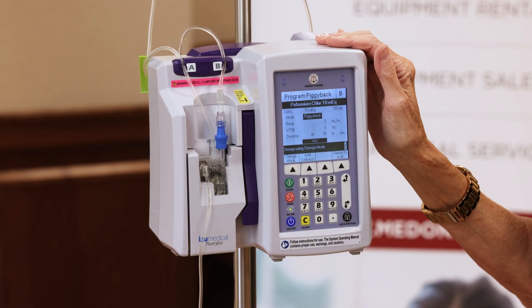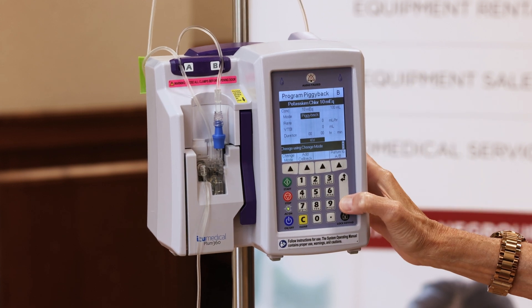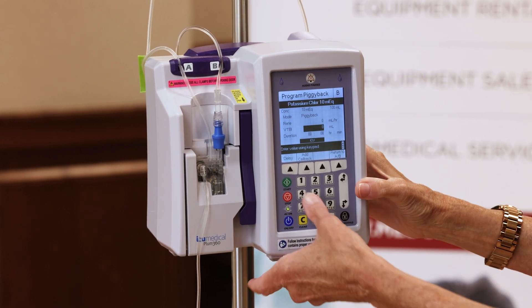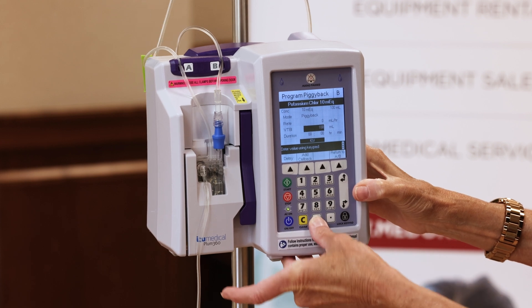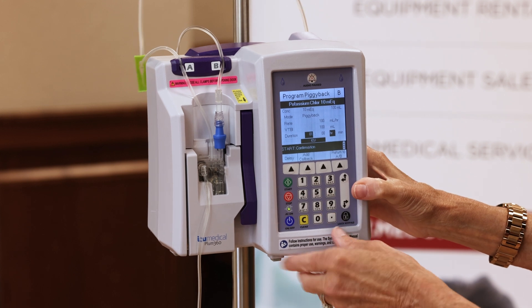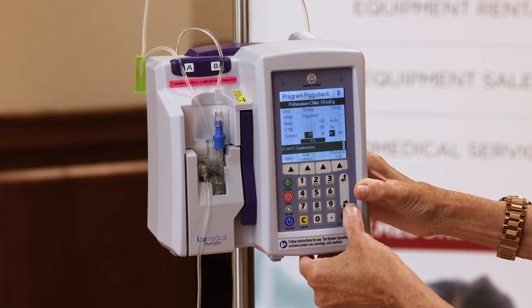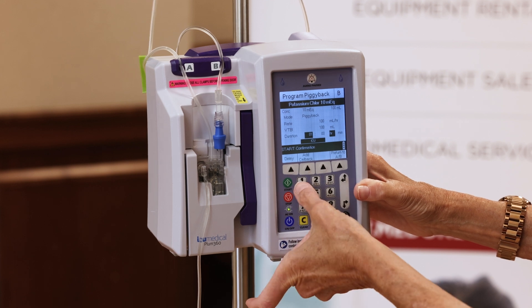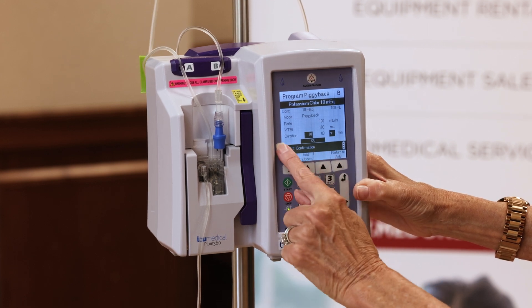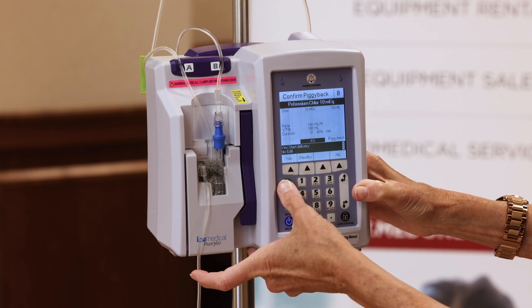Because the doctor ordered 100 mL to go in over an hour, I'm going to select down to the volume, which is 100, and then select down to highlight hours and put one in. Then I'm going to press the green button. I waited for the start prompt to come up, and then yes to go ahead and start this infusion.